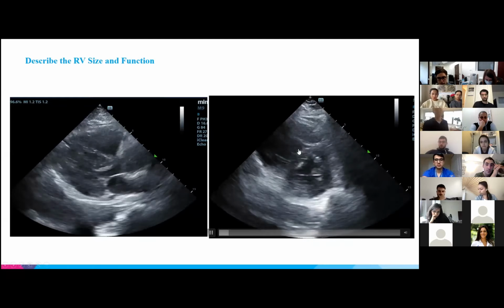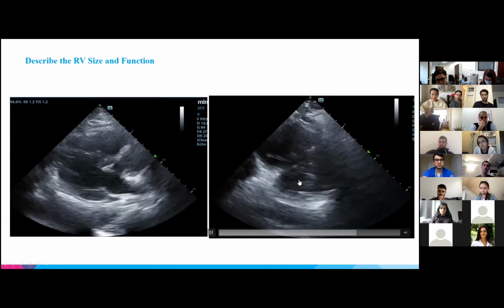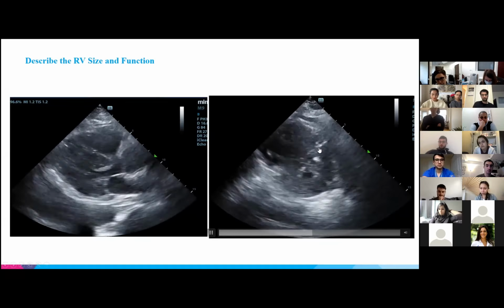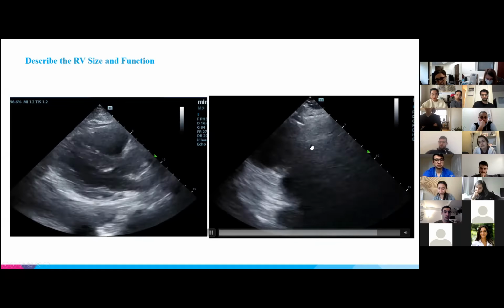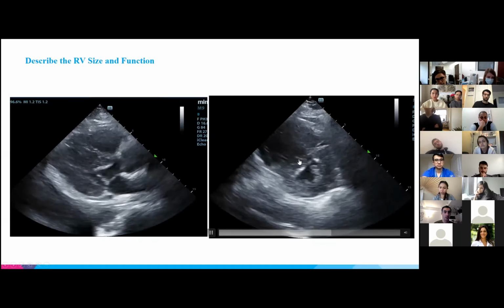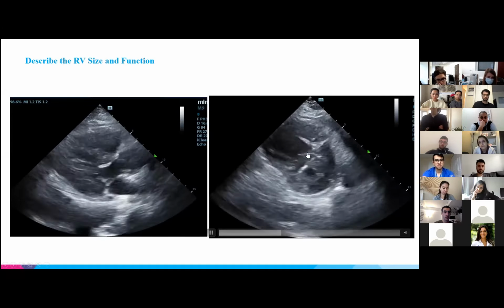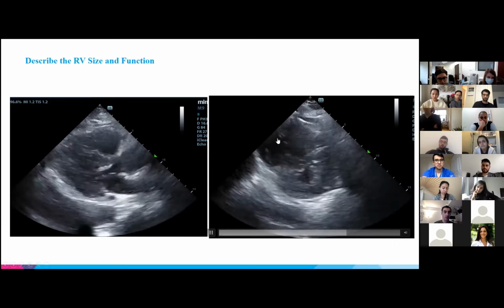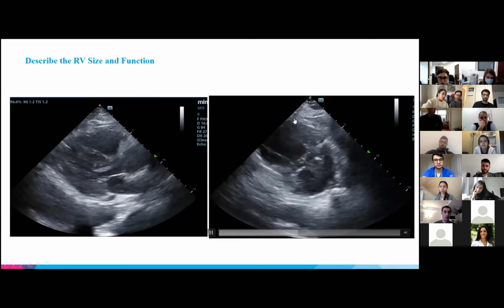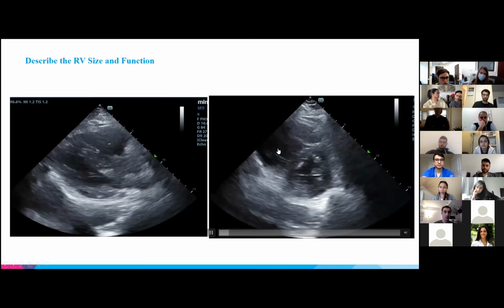Then if I look at the parasternal short axis view, you see your left ventricle down here. Normally, again, it should look like a nice donut shape. And you see how it kind of looks like a D that's been rotated about 45 degrees. So it's a D right here. Anytime the septum moves inappropriately in towards the left ventricle and the RV looks enlarged, that's a sign of definitely RV dysfunction. And I agree, the RV looks very enlarged here. It's much bigger than the left ventricle.